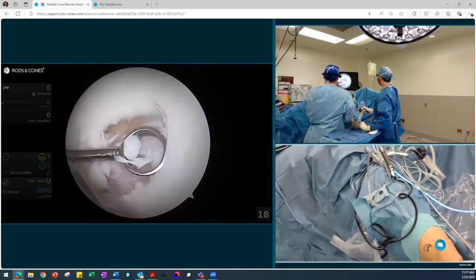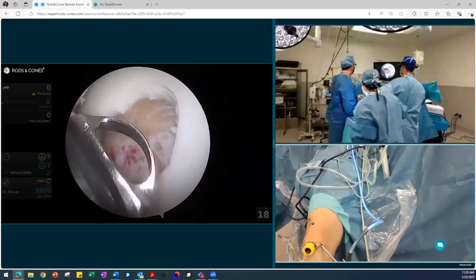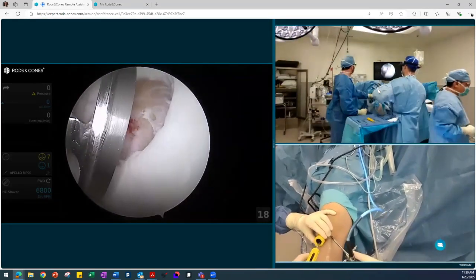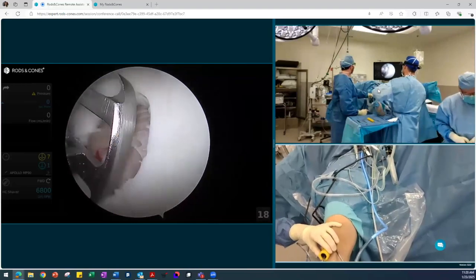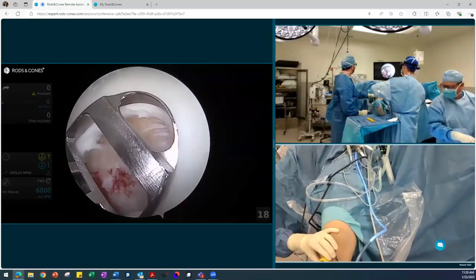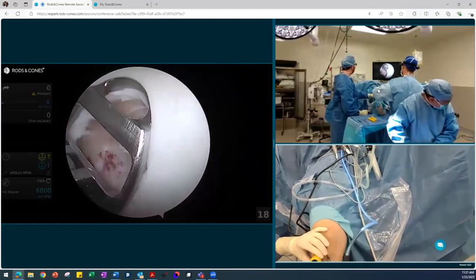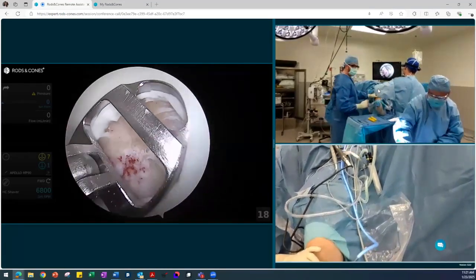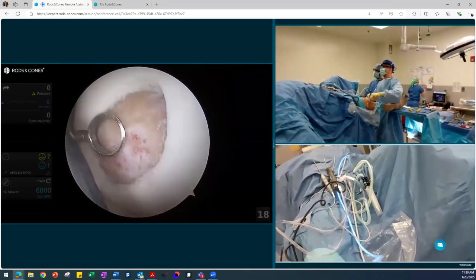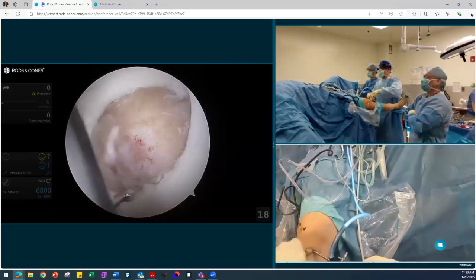You can see that even surrounding the defect, the cartilage was overall slightly poor, and we're going to clean this up to a harder edge. Following this, we're going to place the cutter in again. Again, deployment is important. You have to elevate the cannula sometimes. Following this, we're going to further cut any edges. Again, care is taken here not to make this defect too large, because the MACI implant will have too much gap on either side. You want less than 1 to 2 millimeters.